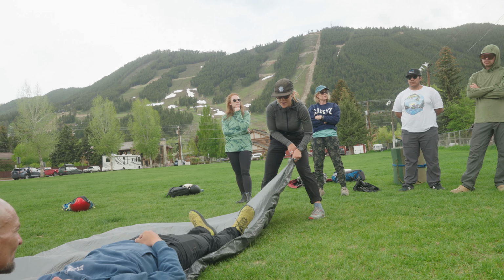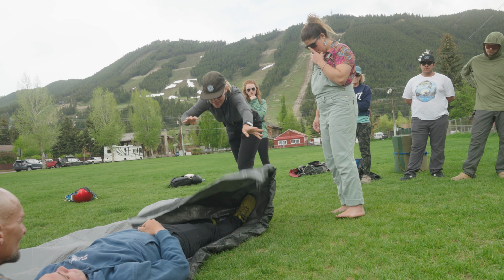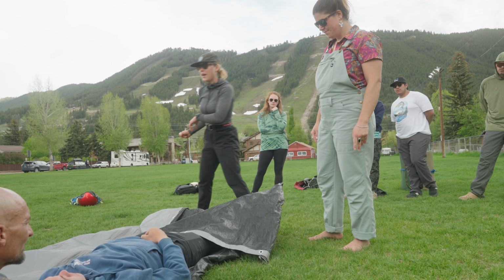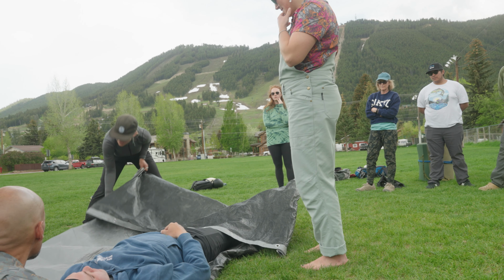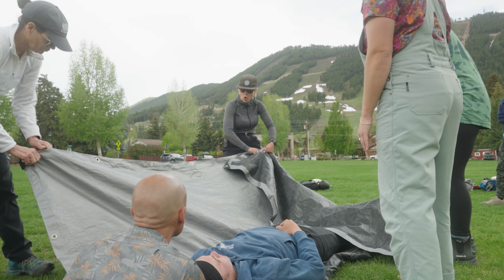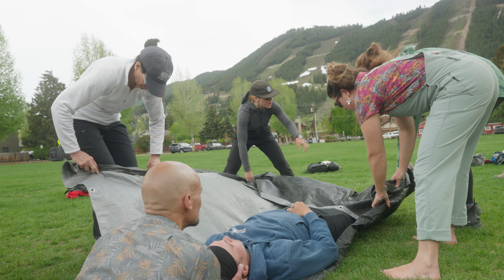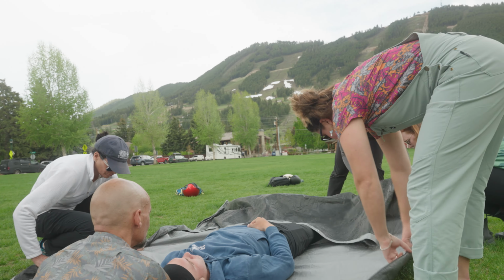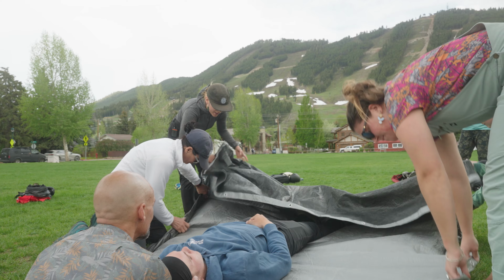Now we're going to unroll this side just a slight bit, and then we'll tuck this in, and now I'm going to have 2 people come on in here and roll that into the patient. Now I'm going to have someone else come on in and pull that in tight. And then we're going to start rolling this in towards the patient. So if it's easier for you guys, completely unroll it. Sure, yeah. So completely unroll it, and then now kind of trap the feet.